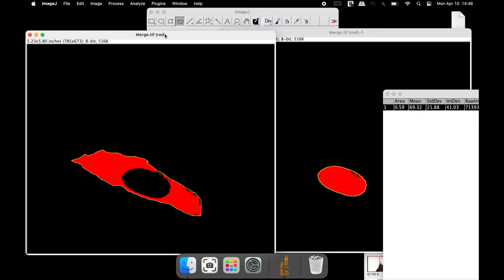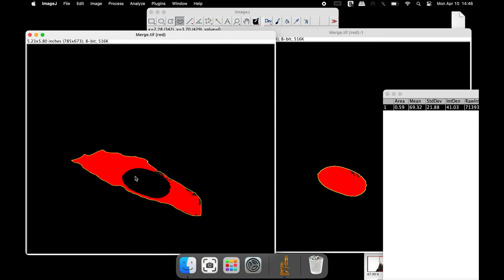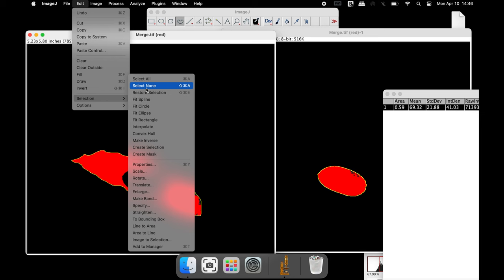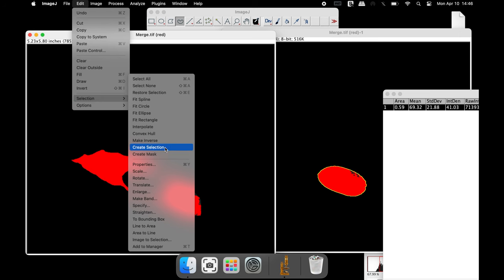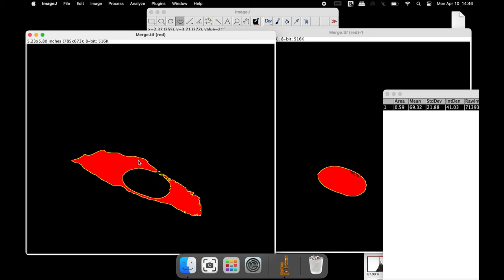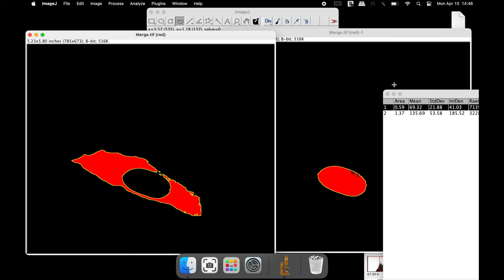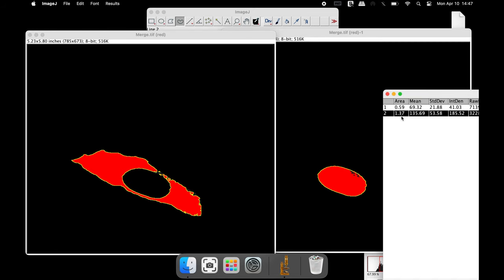To measure the cytoplasmic staining intensity, first deselect the current selection by clicking on Edit, Selection and Select None. To select only the cytoplasmic area, click on Edit, Selection and Create Selection. Now the cytoplasmic staining intensity is ready to be measured — click on Analyze and Measure. The results can be found in the results window.